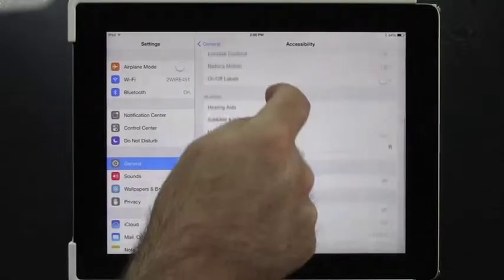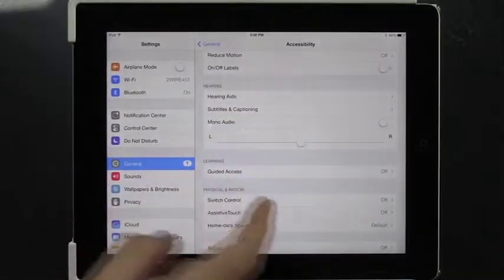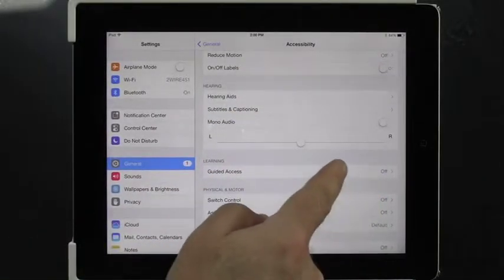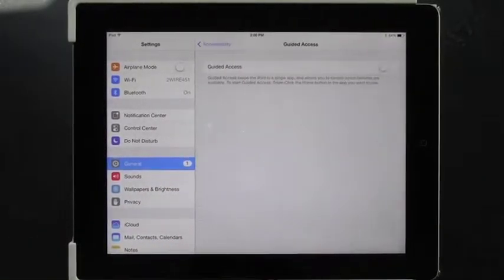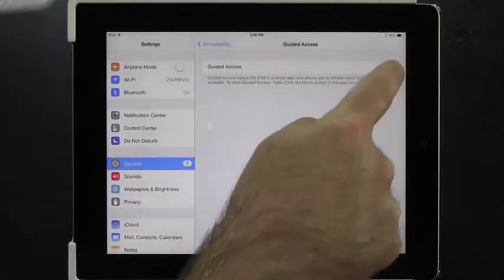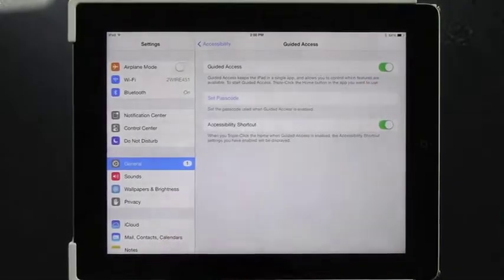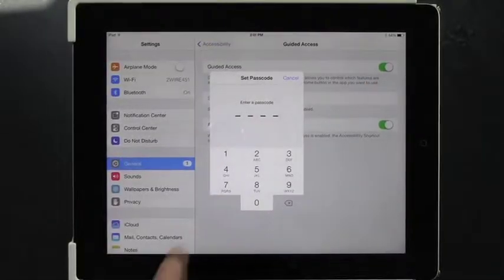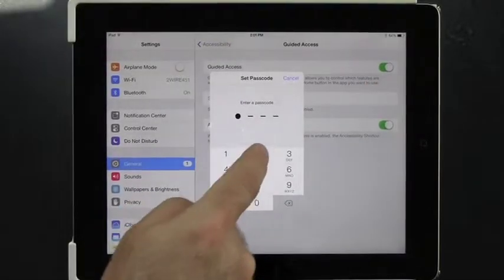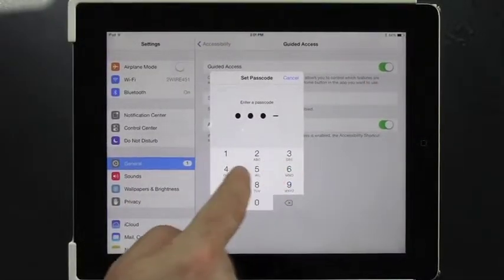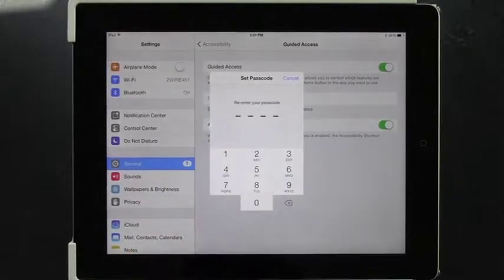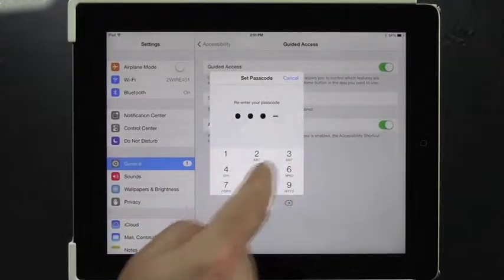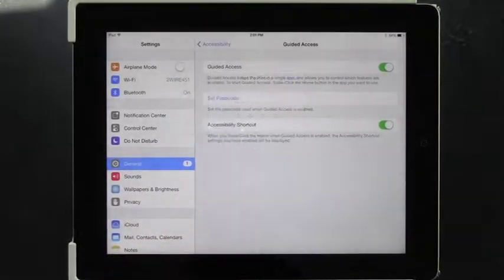We're going to scroll down to Guided Access. Right now it says it's off. We're going to turn it on. We're going to set a passcode — for the sake of illustration, I'll choose an easy one.